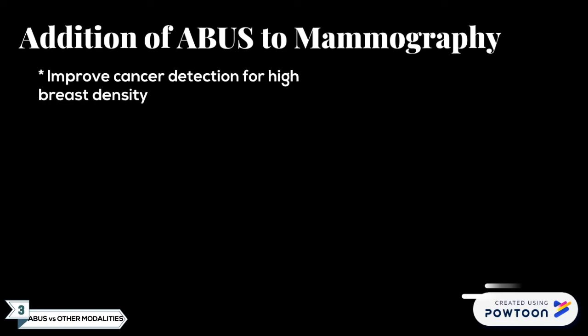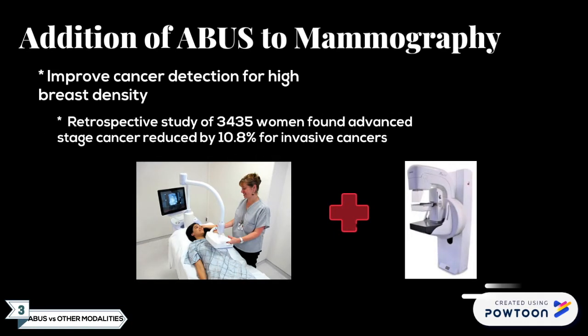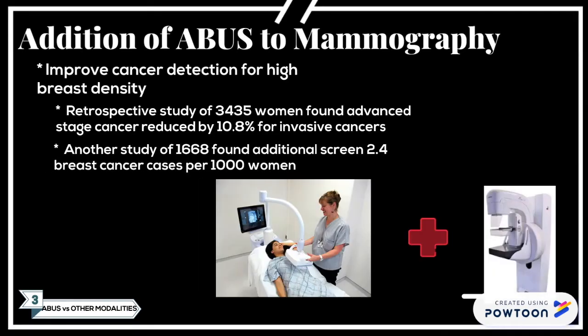A retrospective review of women with increased breast density found that when ABUS was combined with mammography, it reduced advanced stage cancer by 10.8% for invasive cancers. And this is likely due to increased breast cancer detection. Another study involving women with dense breasts found that the addition of ABUS to mammography resulted in the screening of an additional 2.4 breast cancer cases per 1,000 women. Similar findings of ABUS improving breast cancer detection was found in several studies. So overall, there were significant benefits when adding ABUS, but mainly for women with dense breasts.